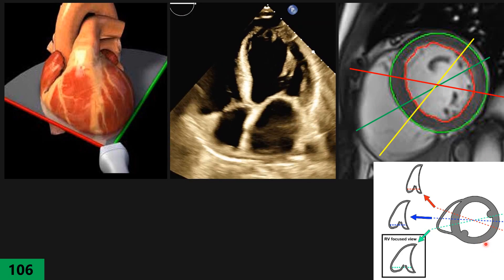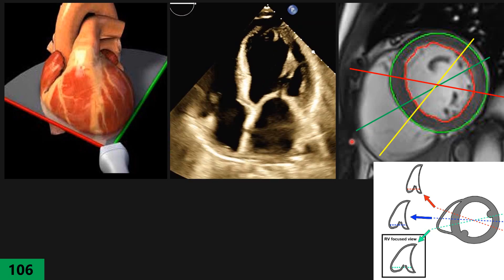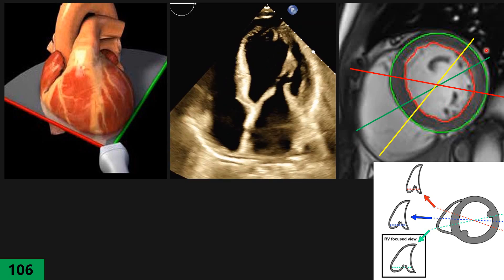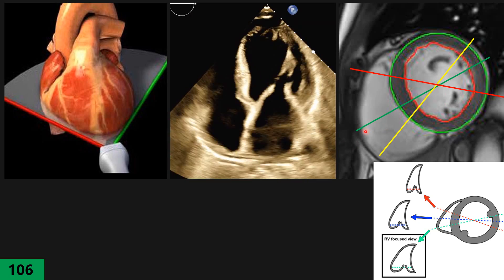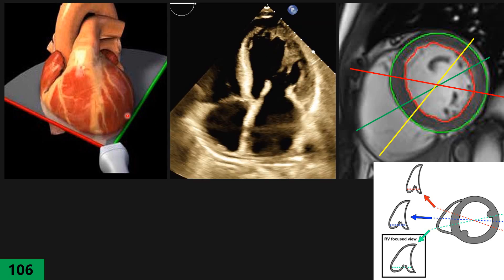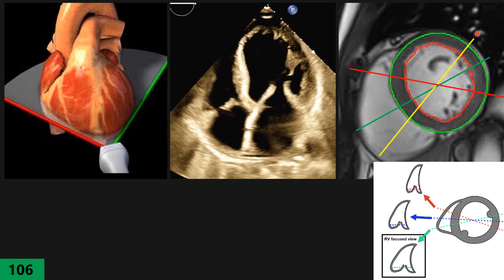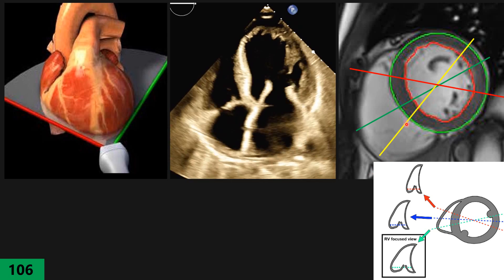On this image they make a schematic and reason that for getting the RV focused view, the green line or cut section represents our classic standard apical four chamber view. For the RV focused view based on their definition, we have to twist the probe counterclockwise from the standard apical four chamber until we see the largest RV without changing LV size, giving us this cutting line. This is the RV focused view based on their definition.